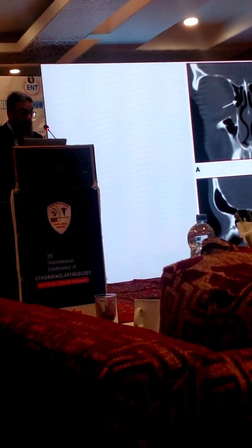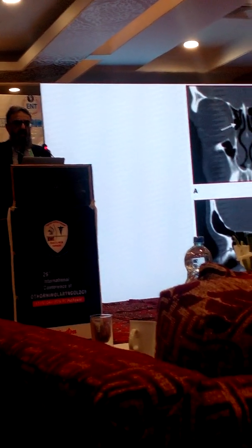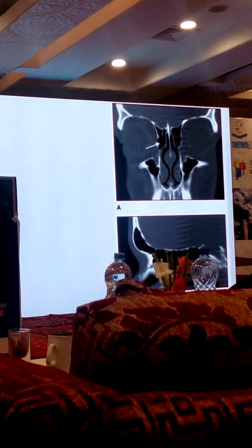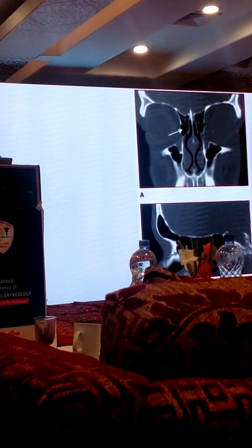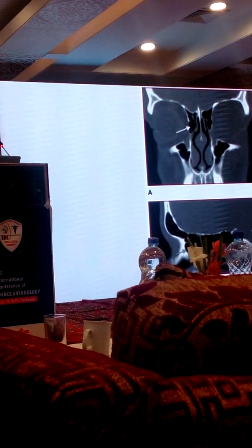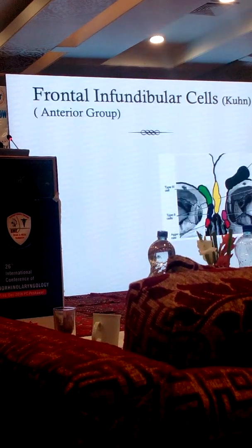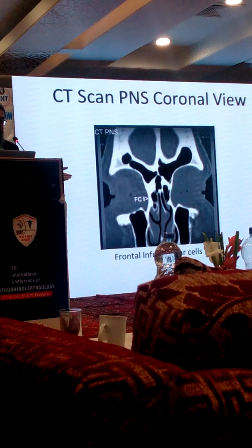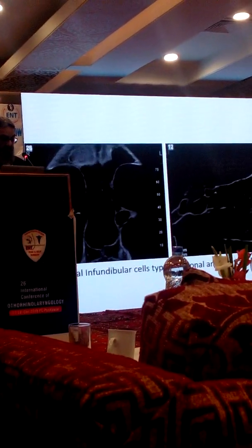Why will you have sagittal? If you want to assess the frontal sinus drainage area, we call it the frontal recess, frontonasal duct. It is the frontal sinus drainage area. You have to see the sagittal scan. And in the sagittal scan, there are two types of cell. Anterior to the drainage area is the agger nasi. Posterior are the posterior cells. Anteriorly there are different types of cell. I don't want to go into the details of that. These are the type 1, type 2, type 3 frontal cells, right?